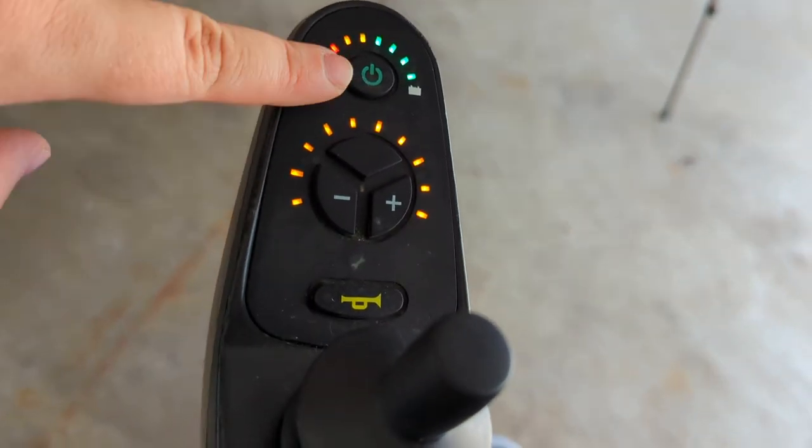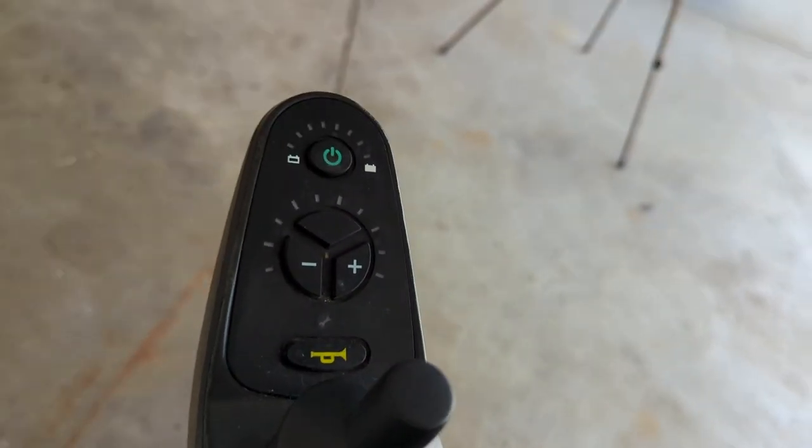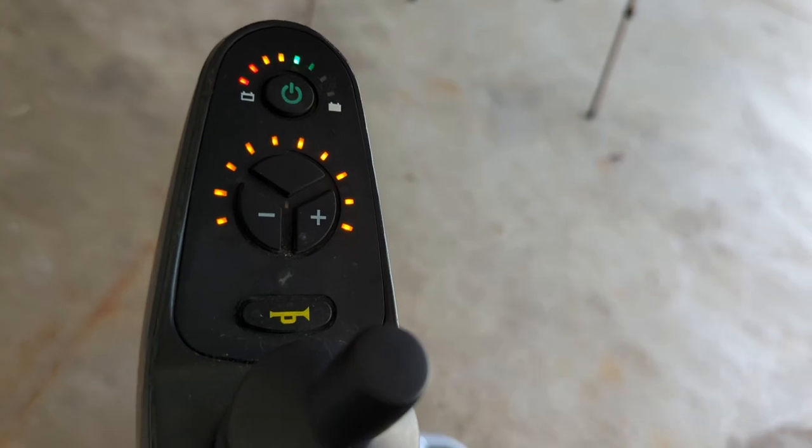Pretty pathetic, honestly. And then this power button — now it's off. And now it's back on again.